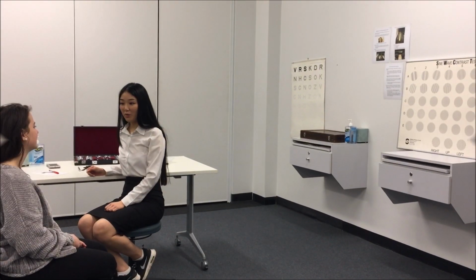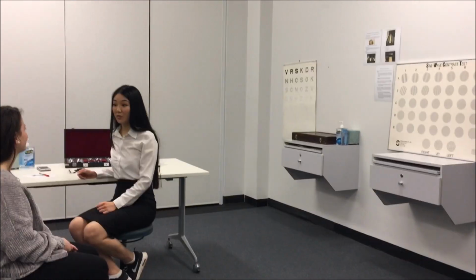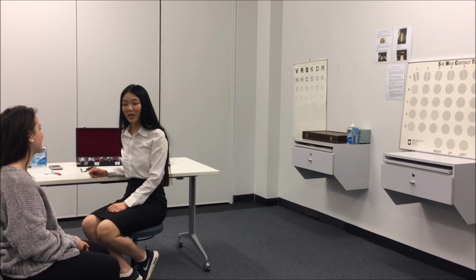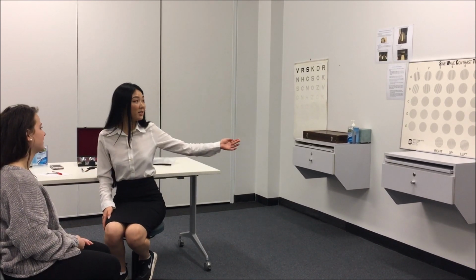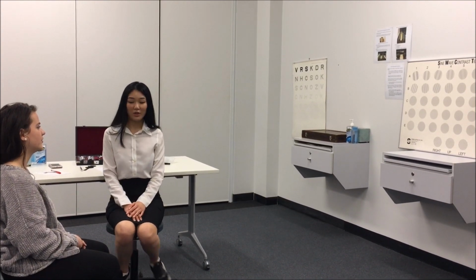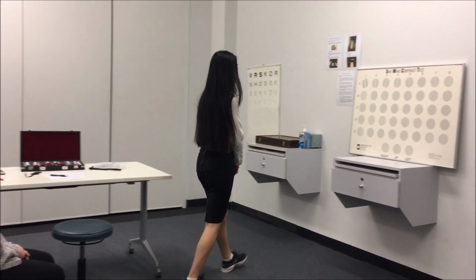So Kaitlyn, I have a referral from your doctor saying you're noticing your vision is a bit hazy, is that correct? Yeah, particularly at night. Okay, so we're just going to perform a sine wave contrast sensitivity test. Have you ever done one of these before? No. Okay, that's okay. I'll just explain it to you quickly.